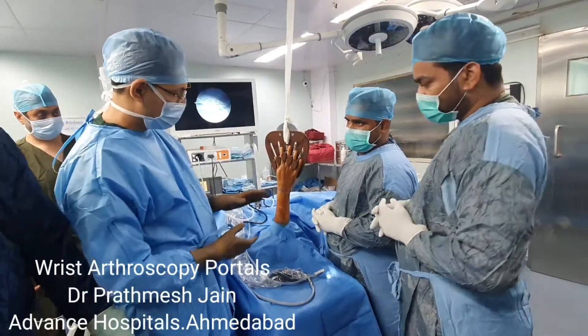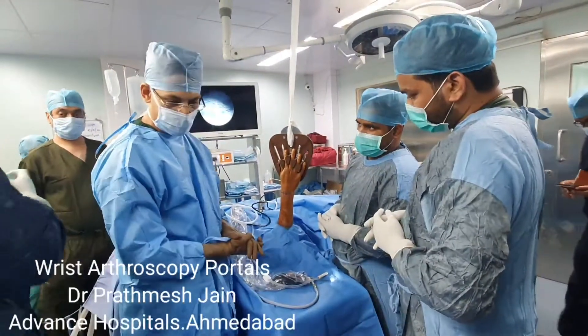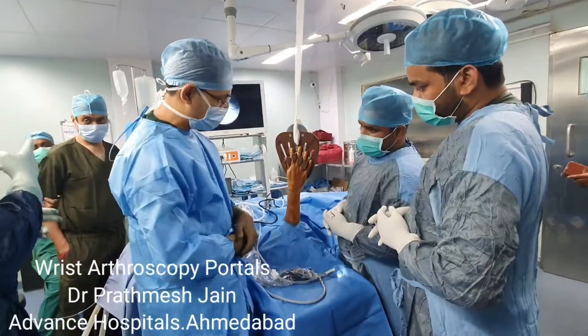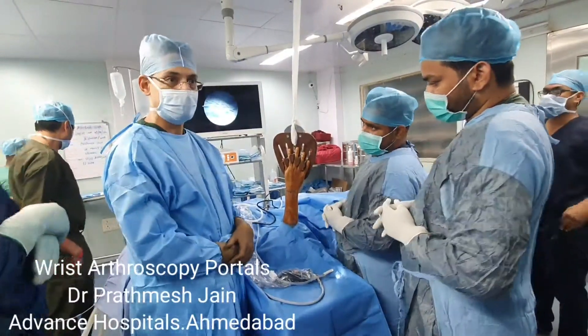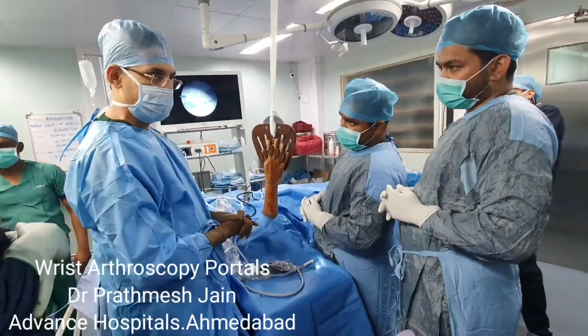Today we are talking about the positioning and the portal placement of the wrist arthroscopy. As we all know, the extensor compartment of the wrist has six tendons, and the portals of the wrist are based on that.